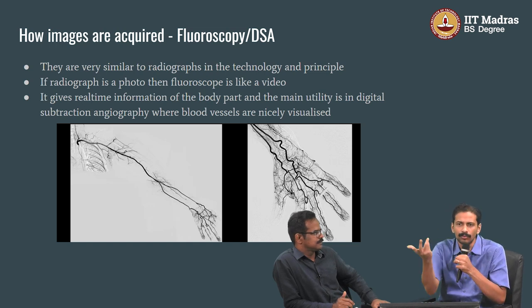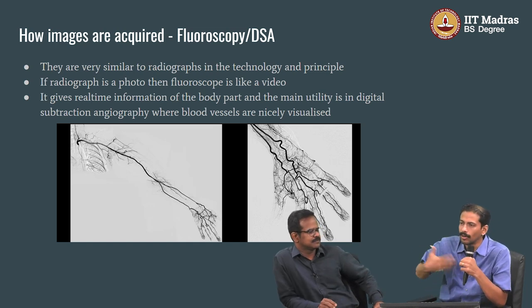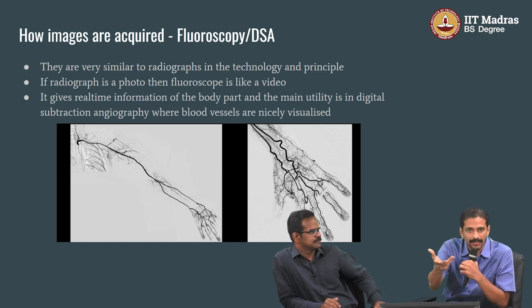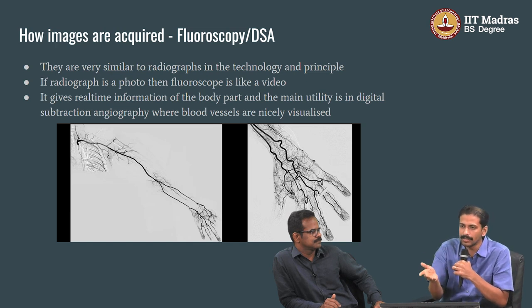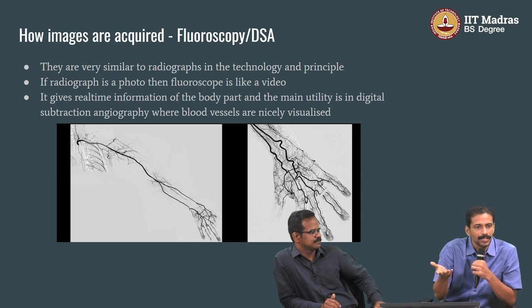Roughly, this is called an angiogram, or angio. You must have heard of angio, right? Cardiac angio or whatever angio. They inject contrast into those vessels to visualize them. It gives some contrast to those vessels, and you can look at them. You can study the anatomy. Is there a blockage? What is the shape? What is the caliber? These are the kinds of information you can get.